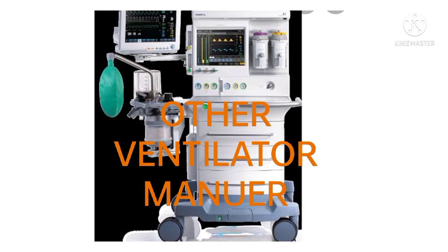ECMO is a modification of cardiac bypass and involves partially removing blood from a patient with large bore catheters, infusing O2, removing CO2, and returning the blood to the patient. This intensive therapy requires systemic anticoagulation and is a time-limited intervention. A skilled team of specialists, including a perfusionist, is required continuously at the bedside.